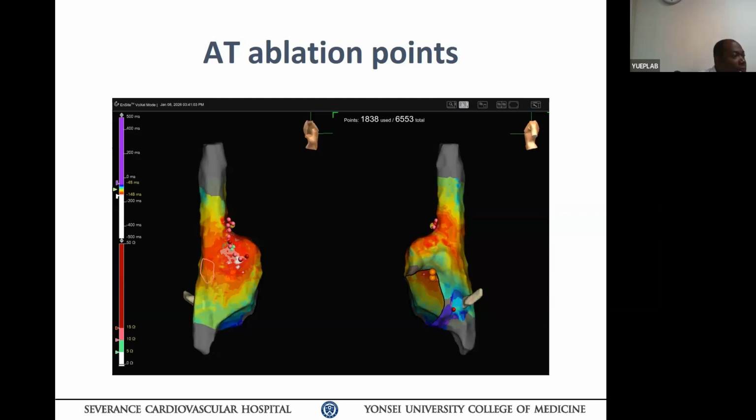In this patient, the sinus node exit site is a little away from the target site. I'm sure it is. I used high output pacing during the burn, so it always matched, with capture. So for high crista tachycardia ablation, do the sinus node map first, then ablate the crista focus, okay? Don't mess around, especially near the phrenic nerve, the same way. All of this is an important maneuver you have to do.